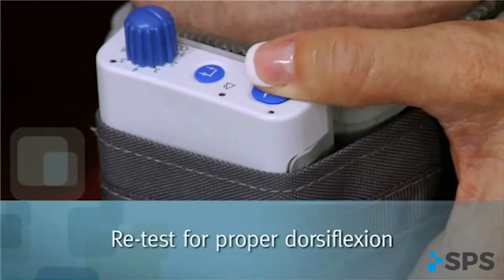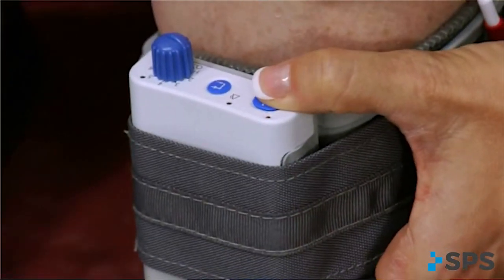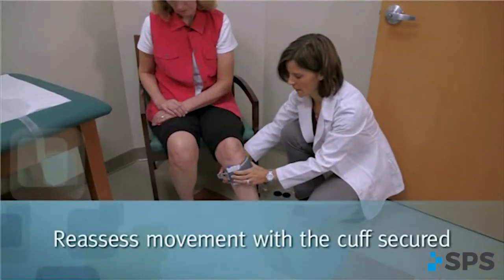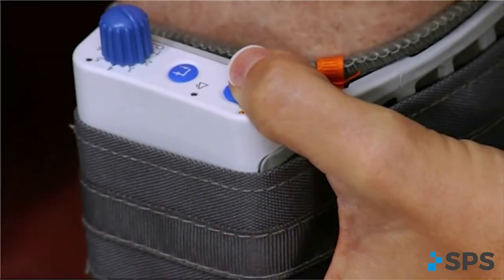Retest the electrode placement by pushing the stim button to assure the optimal functional foot lift. If the response is lacking, make sure the cuff fits snugly. Readjust the cuff or reposition the electrodes as needed. Retest after each change to assure the appropriate response. At this point, the patient is ready for data collection and programming.